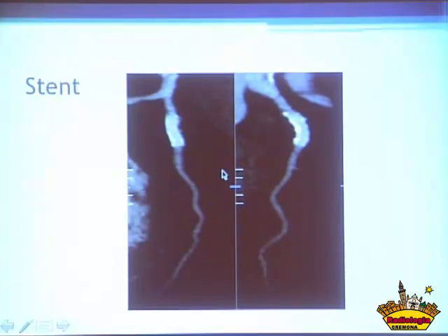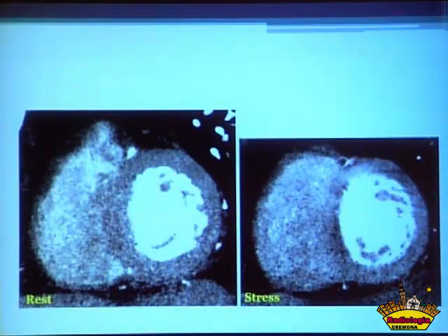And in the right coronary artery and left coronary artery, there were a couple of little areas that we weren't sure about either. And this was their perfusion scan. So their rest scan here, and their stress scan here. Now, this horizontal streaking is some beam hardening artifact. And you've got to be very careful not to count that as a perfusion defect. And you can tell that it's a bit streaky, it's not present in every single phase.